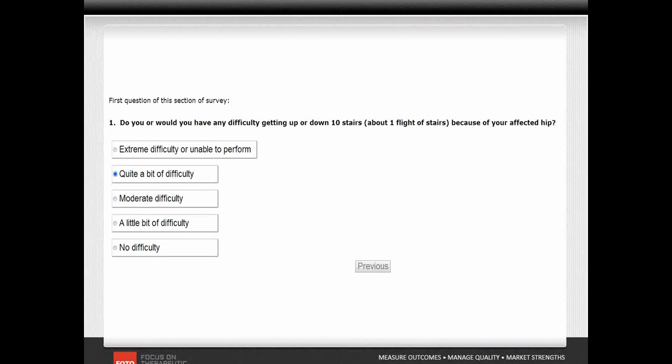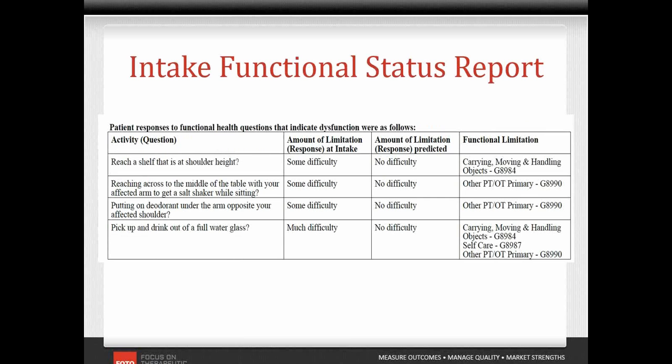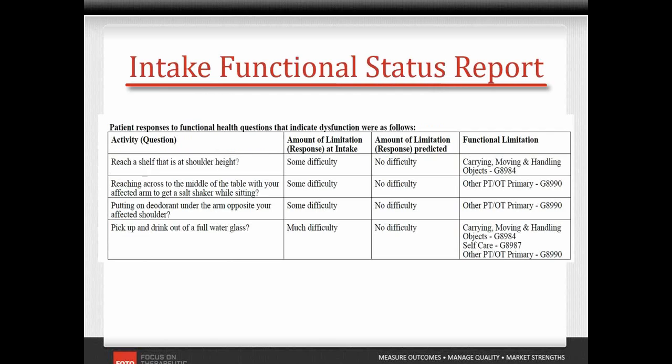The intake assessment averages six or seven minutes and the status update usually only requires about four minutes. The system scores the assessment electronically and the results are reported on the intake functional status summary. Each functional activity that was selected for the patient is listed along with the response provided by the patient about his level of impairment.